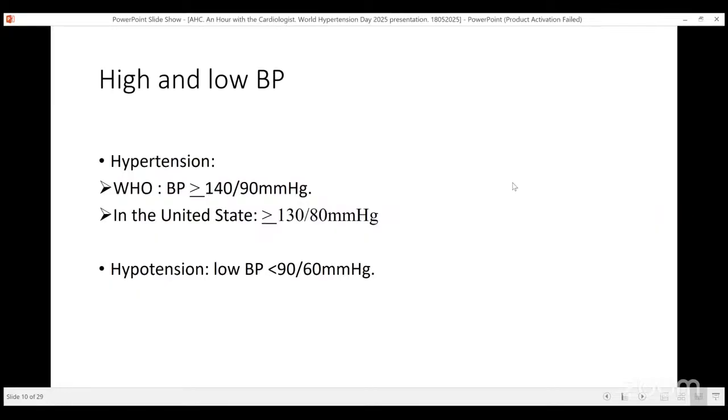Not just white coat hypertension may be as a result of anxiety, but you may also need to do ambulatory blood pressure so that even the one at home can be measured while you are not anxious, while you're unaware of it. They just put a device on you. You take it home, it will measure your blood pressure even at home, even when you are sleeping as well, and then you return it, and then they can look at it. Real white coat hypertension, blood pressure is normal at home, is elevated in the hospital.